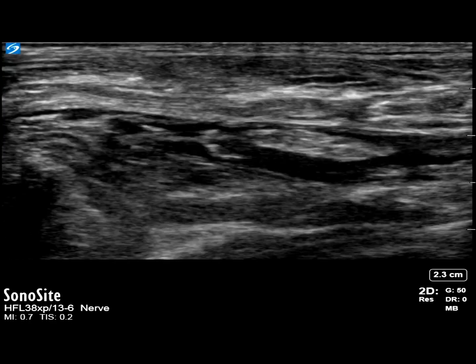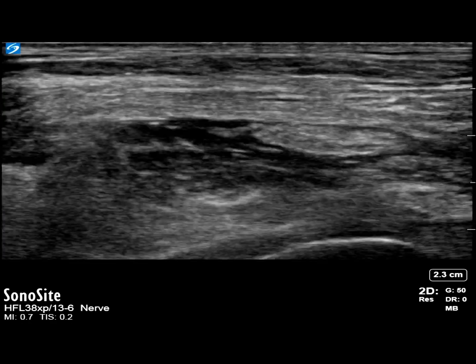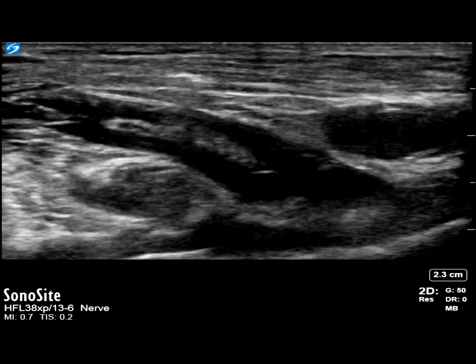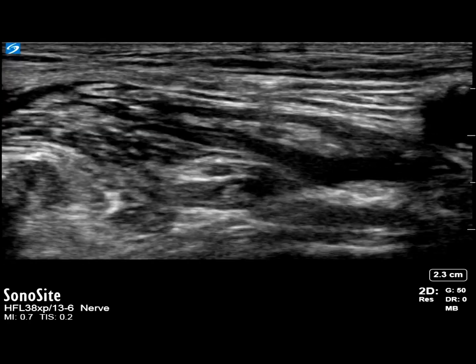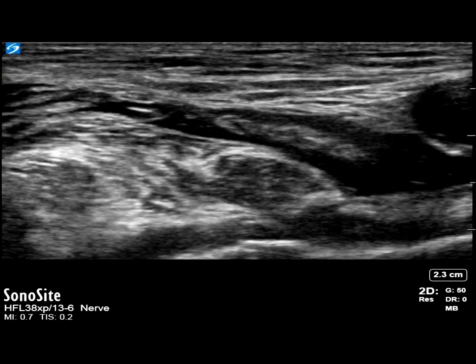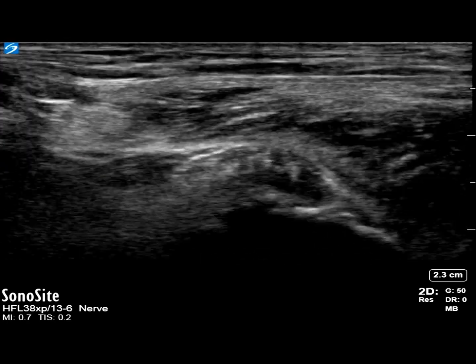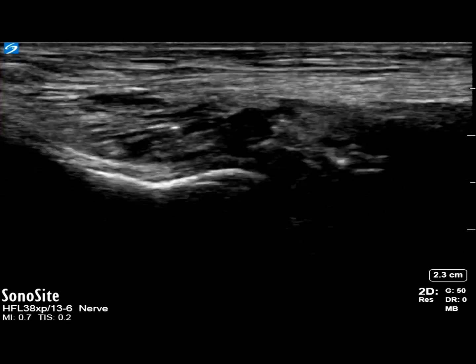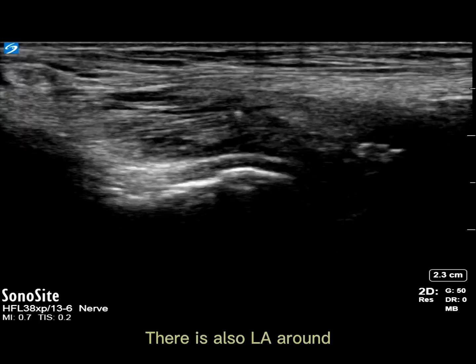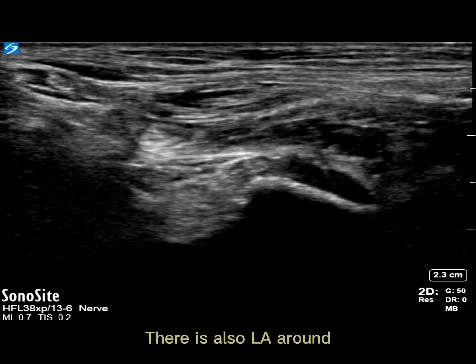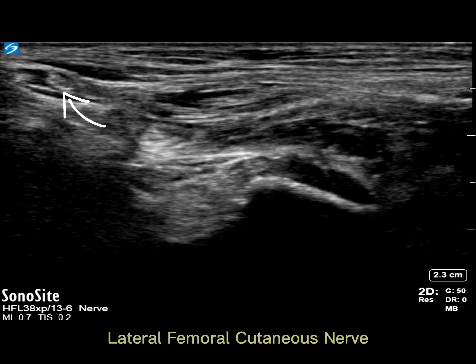This is my general practice to do a post-injection scan to confirm the spread of local anesthetic. We also scan the thigh laterally, and interestingly we note the spread of local anesthetic around the lateral femoral cutaneous nerve of thigh.